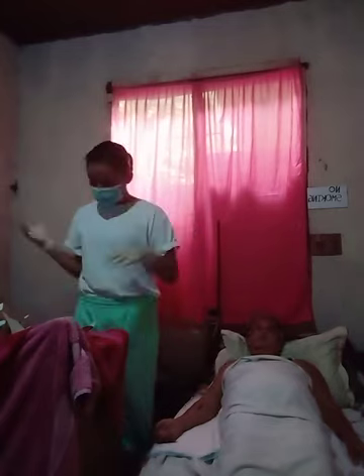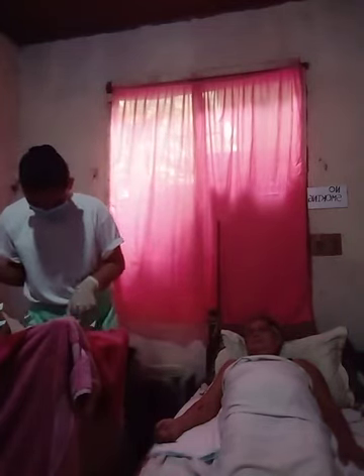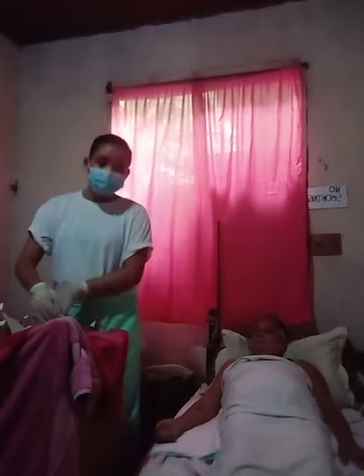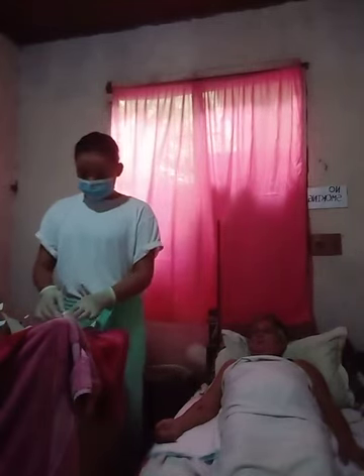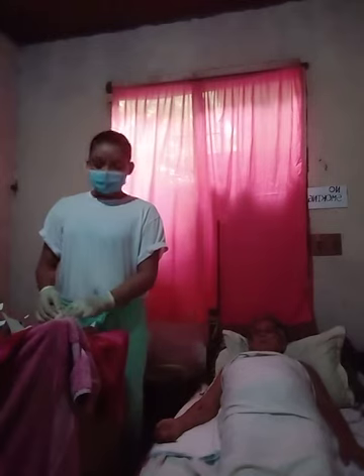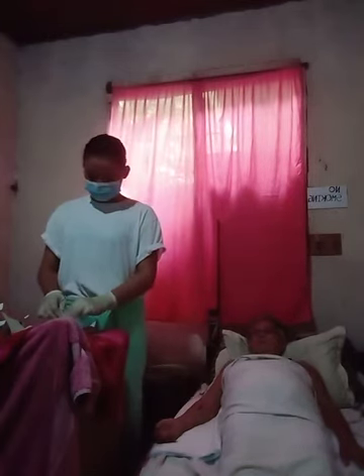Next, after inspecting, clean the wound. Apply the moist fine mesh gauze in a single layer directly onto the wound surface.